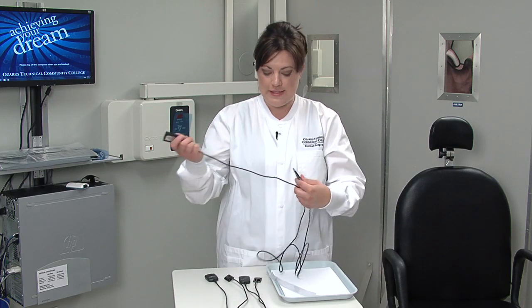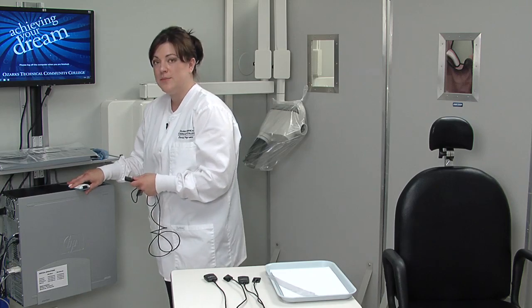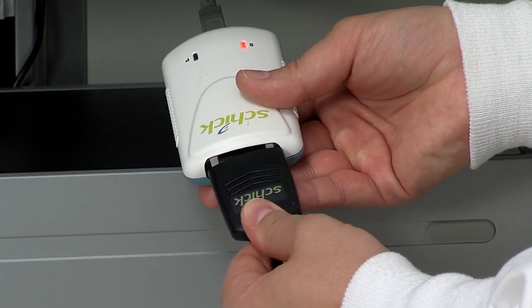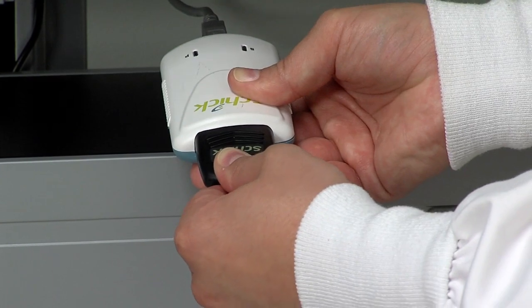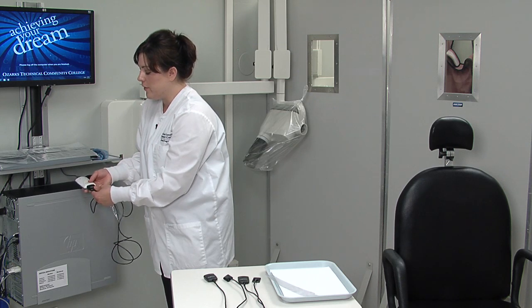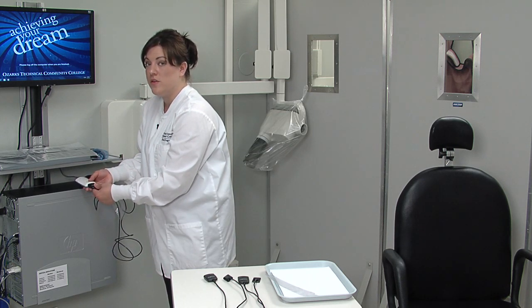So to plug this in, you want to grasp the remote as much as possible, and then you'll insert the connector into the prongs. You want to try and insert it as straight as possible, but some of these do have quite a tight fit. And then once it's inserted properly, your computer screen will show a signal that your sensor is ready for use.